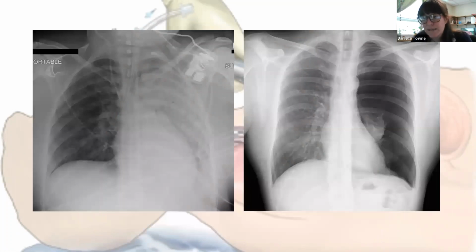All right, so chest x-rays are typically done after an intubation and they confirm tube depth, but that's it. Because the trachea lies directly above the esophagus, when you do an anterior posterior chest x-ray, it's not going to show if the tube is in the trachea or the esophagus because they lie on top of one another. So it can be in the esophagus and look good, but it's not, right? It's only actually showing you your depth. That's the only thing that we're typically using a traditional AP chest x-ray for. And that's why it's not really prioritized right off the bat for tube placement. It can be several minutes, or longer, before a chest x-ray is done after an intubation.